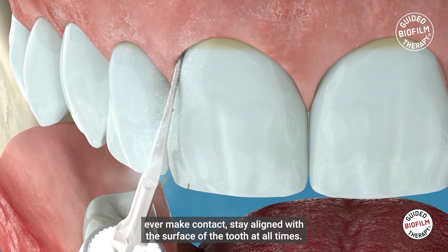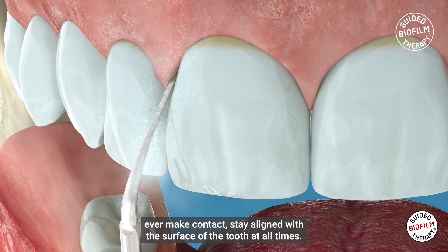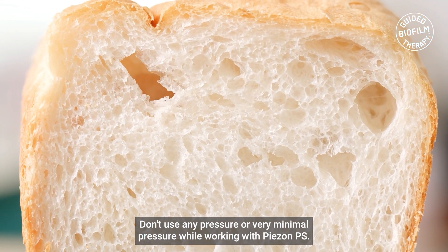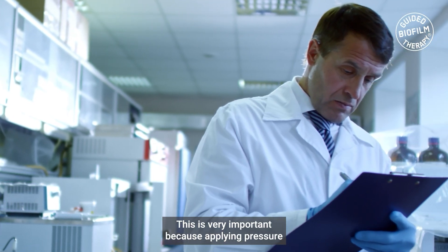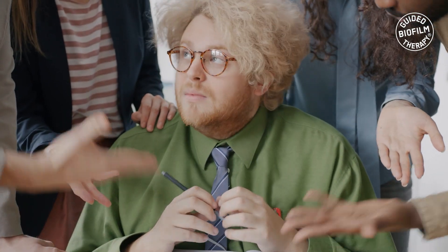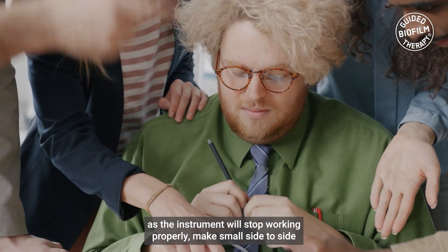Stay aligned with the surface of the tooth at all times. Don't use any pressure or very minimal pressure while working with Piazon PS. This is very important because applying pressure will contribute to a decrease in efficiency as the instrument will stop working properly.